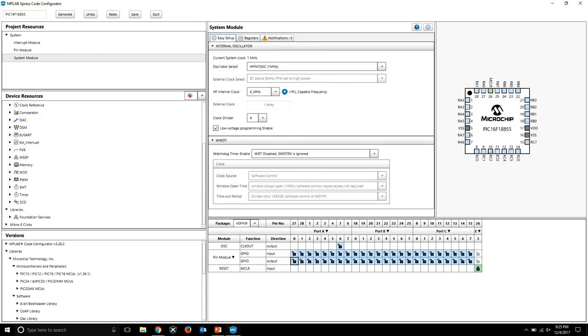And we already talked about the graphical representation of the MCU to the right. Down below you have the pin manager, which we'll use later on. So it's pretty simple, pretty self-explanatory. All right, the first step we are going to do is add the click board.